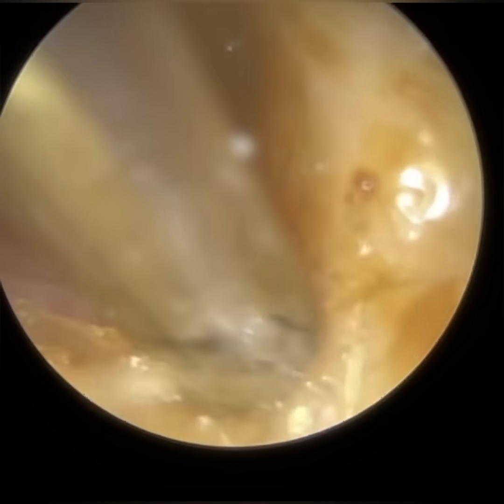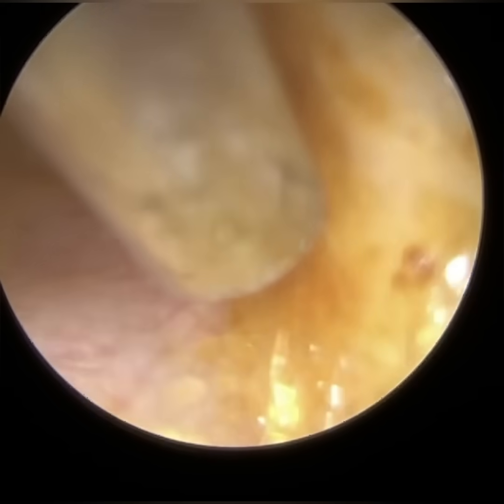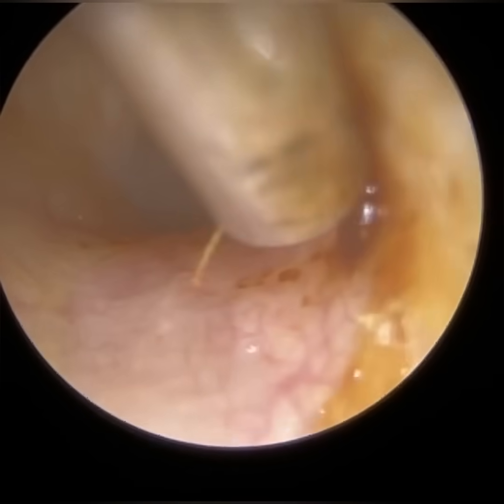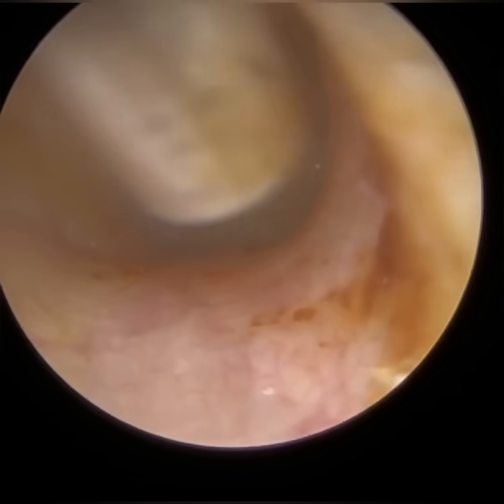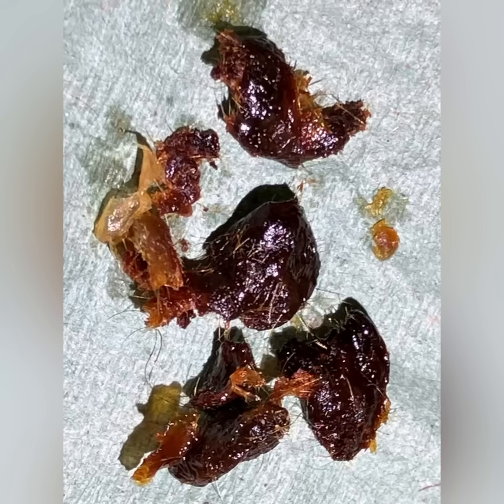Just mopping up near the entrance. These are younger patients, hence why they've got translucency of the eardrum. I'm just using the fine end. That's all the wax — you can see how dark it is. You can see that sheet of dead skin at about nine o'clock on the screen. That was the section in the left ear I had to remove before going back to extract the wax, because it was causing too much noise — too much clarinetting.